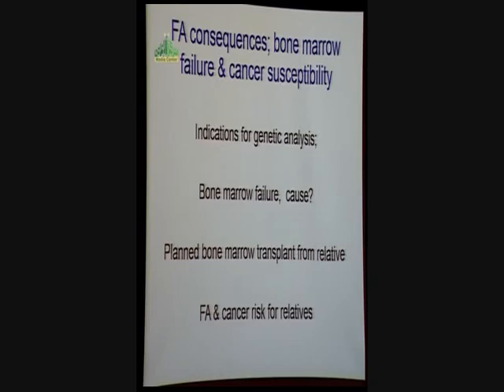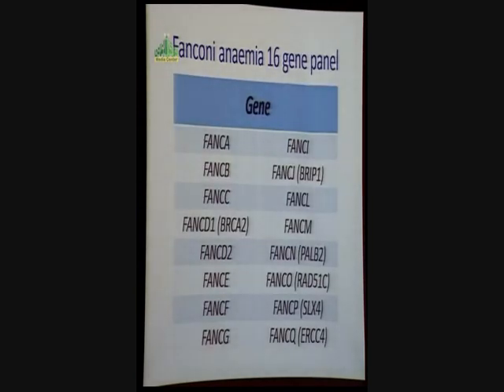So Fanconi anemia can lead to bone marrow failure and cancer susceptibility, and patients are often referred to us for genetic analysis to look at the cause of the bone marrow failure in that individual, and whether it is due to Fanconi anemia. So we can attempt to identify the causative mutation in the index case, look at relatives subsequently where we can identify a mutation to see whether they're relevant as a bone marrow donor, and also look at relatives to see whether they have an elevated cancer risk because of some of the genes that are associated with the disorder.